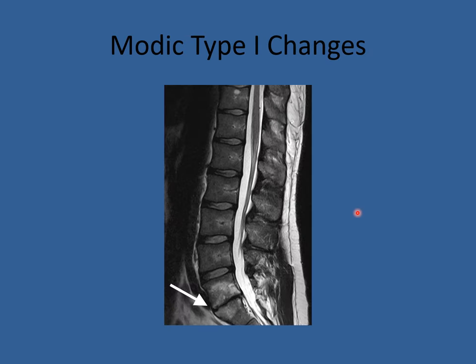Disks can degenerate to the point where they no longer absorb shock and become mechanically incompetent. You can see the disk is flat, losing the smooth unbroken end plates — they look ragged with irregularities in an almost sawtooth pattern. This is isolated disk resorption, where the impact of one vertebra on the next creates fractures of the end plates. You can also see swelling from the white of the disk space going into the vertebral bodies as a reaction to increased stress. This is called type one Modic changes, named after the radiologist who discovered them.